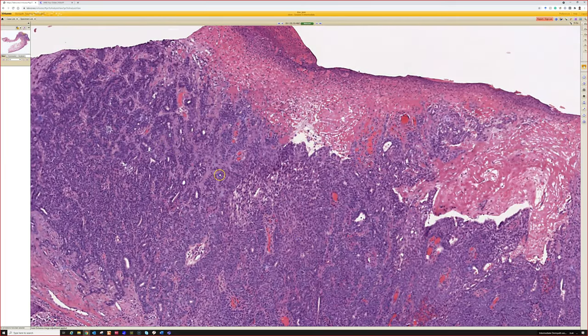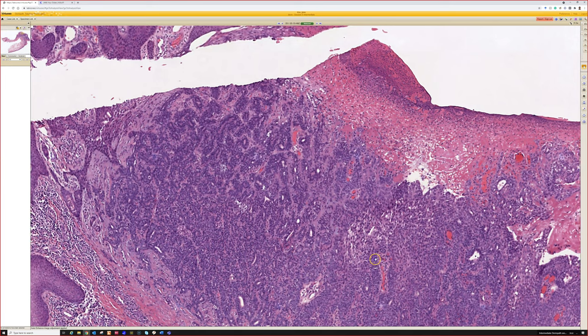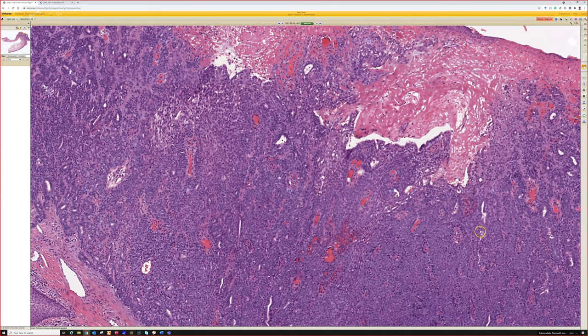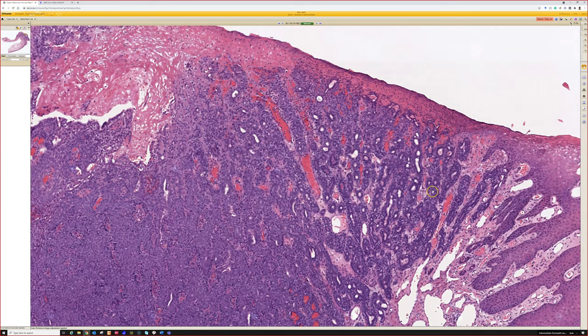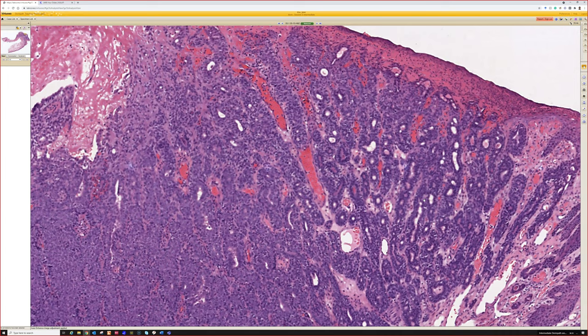Yeah, this probably is a papillary digital adenocarcinoma. It used to be called aggressive papillary digital adenocarcinoma. There's been a recent trend to get away from that because, I mean, it is cancer, but it's not more aggressive than, I don't know, it has a 20-some percent chance of metastases, but it's not like 90% of people die from it or something like that. So some people have challenged and said we should drop the aggressive from the name, even though historically we've done that.